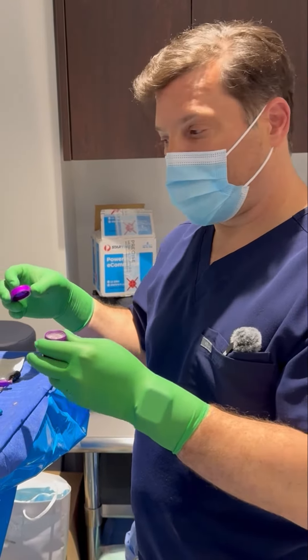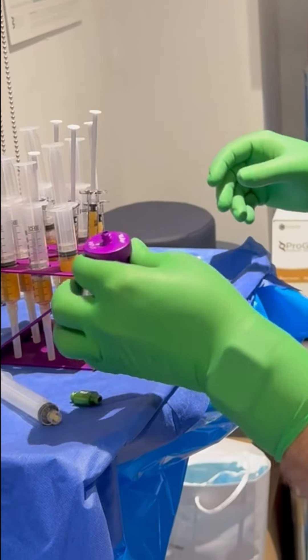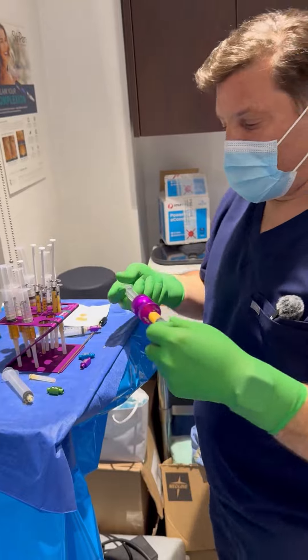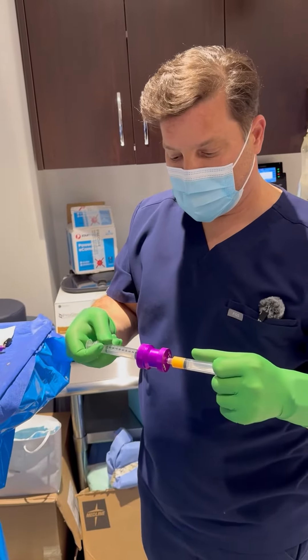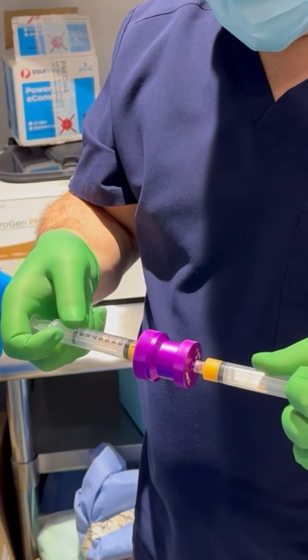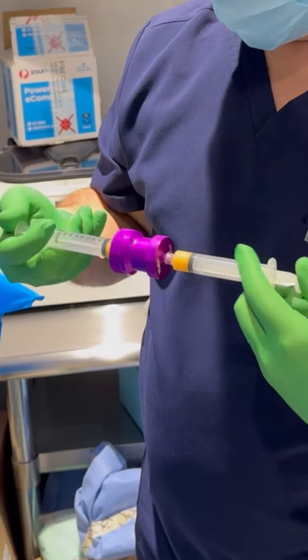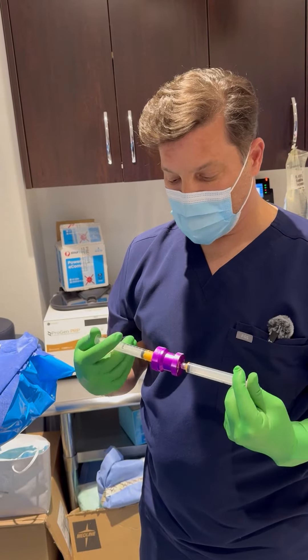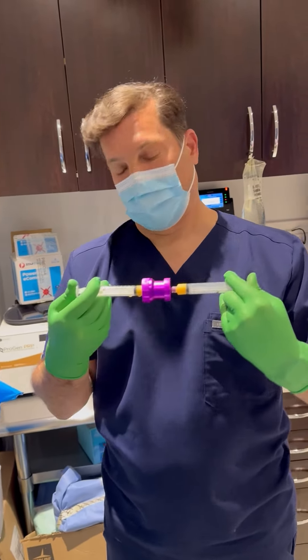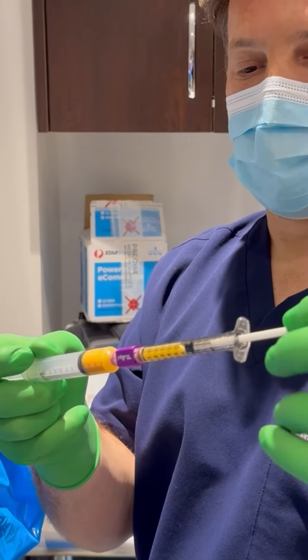Next we're going to create some nano fat. This is the filter that creates the nano fat. It's the same process but a lot more pressure is required because it's a very, very small filter to get it down to stem cells. This is going to be the smoothest of all the fat — this is our nano fat stem cell.